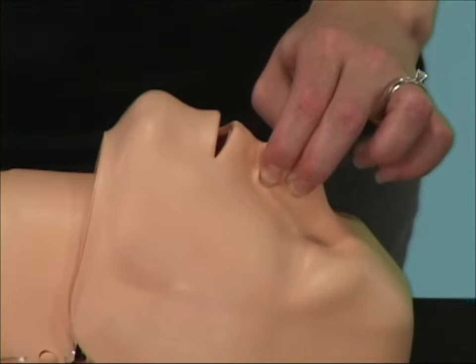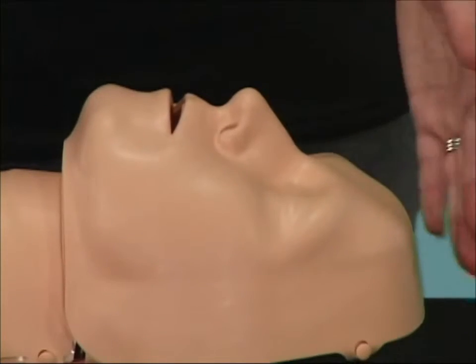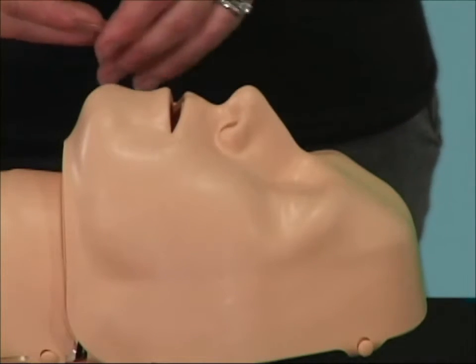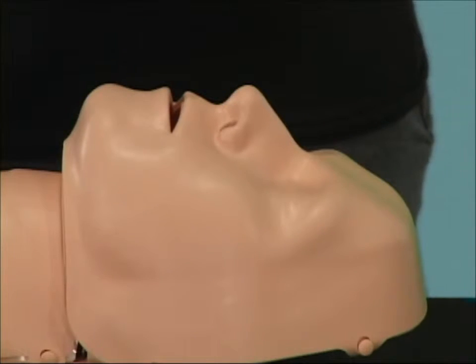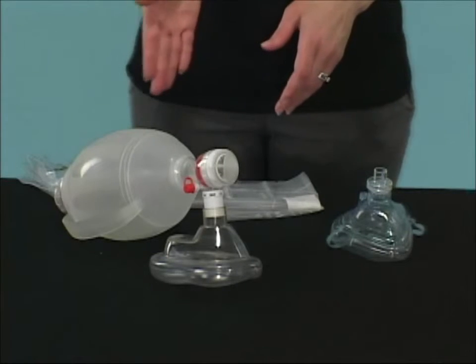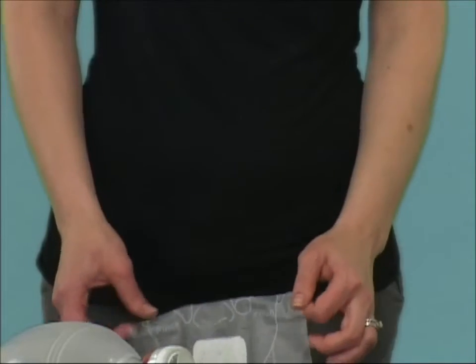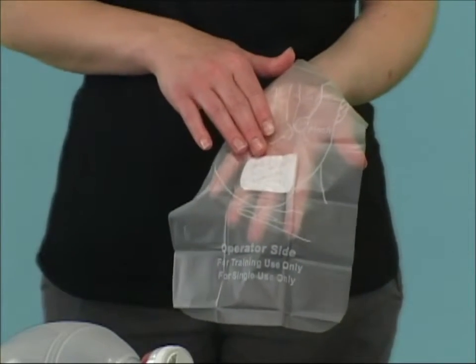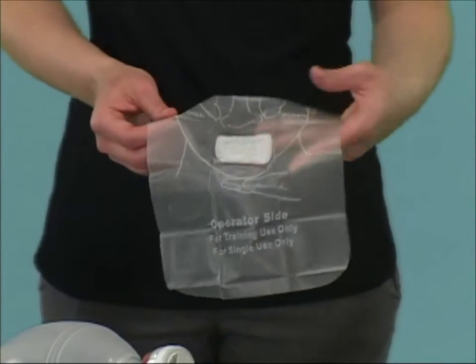In other words, if the nose is not pinched at all, or if the nose is not pinched properly, even if the head tilt is done properly, the rescue breaths will escape through the nose and not inflate the lungs. The PractiMan works well with mask-mouth and mask-bag ventilation. As far as contact with the mannequin's mouth, an inexpensive barrier device with a filter is all I need to avoid catching anything from other users.